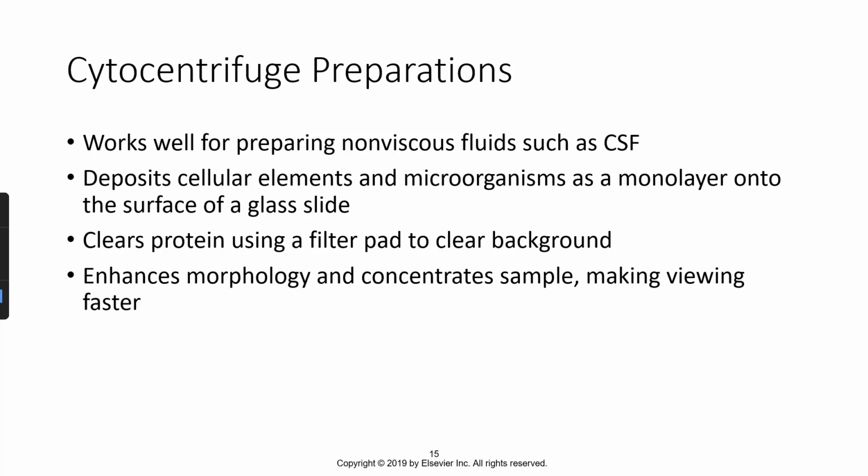Cytocentrifuge works well for preparing non-viscous fluids such as cerebrospinal fluid. Deposits the cellular elements and microorganisms as a monolayer onto the surface of a glass slide. Clears protein using a filter pad to clear the background. And it enhances morphology and concentrates the sample, making viewing faster.